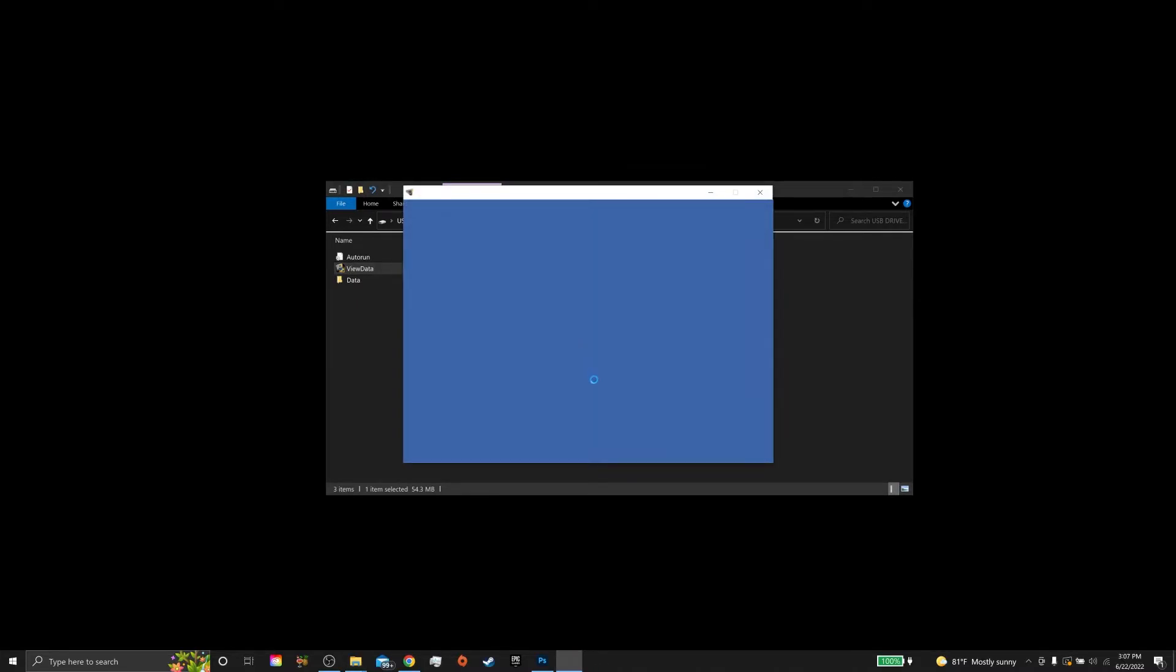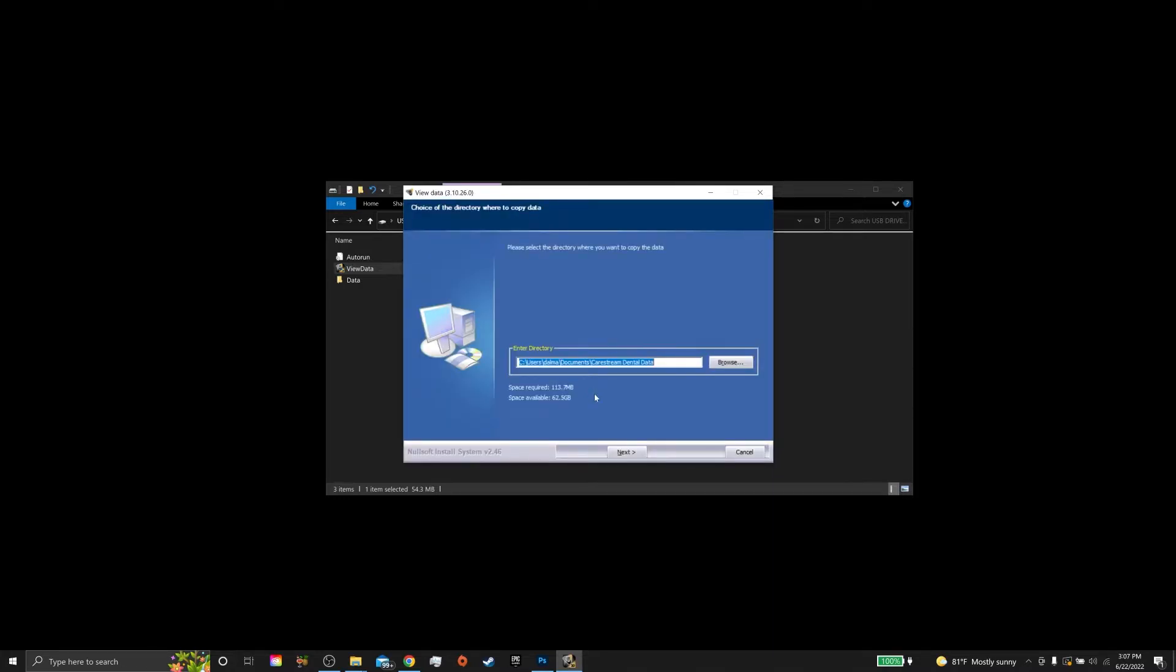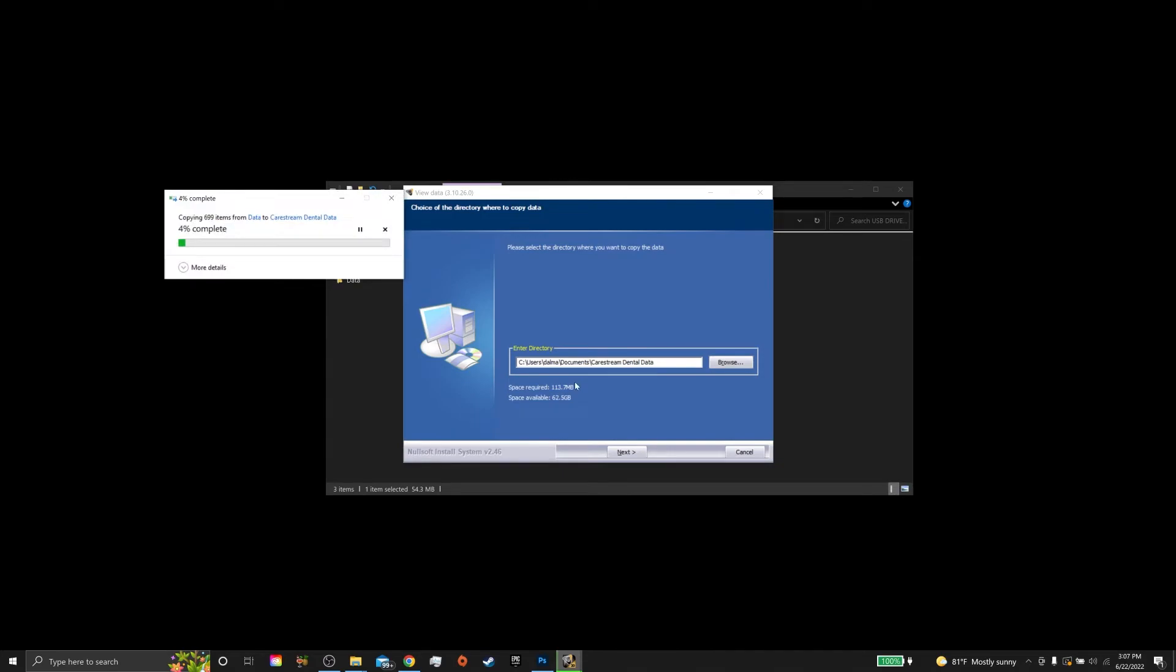There are a couple of prompts to go through here. Now, the downside to this is you don't get the 3D reconstruction because it's a light viewer intended to be viewed on any workstation. This isn't a big deal to many people, as long as you get the radiographs to go through.